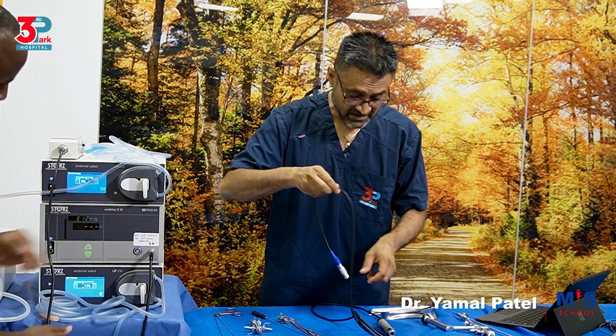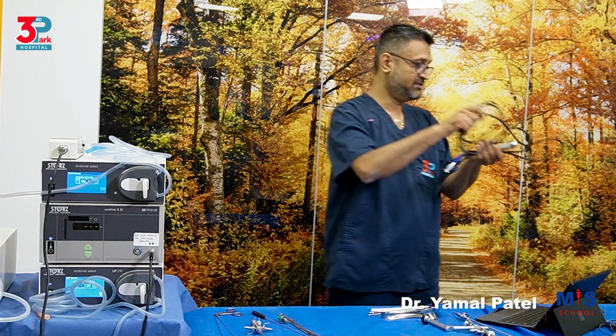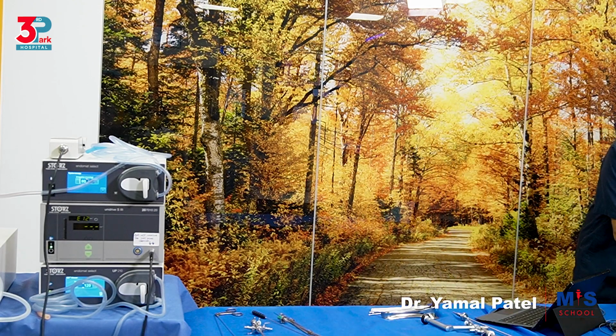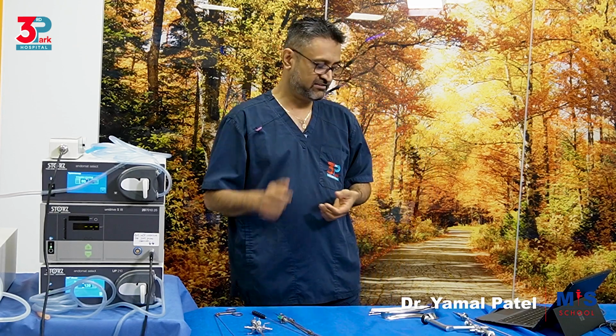Please keep these things safely. These are very fragile equipment. You don't want to have anything damage this. Now let's move on further. We now go into the operating or hand instruments.